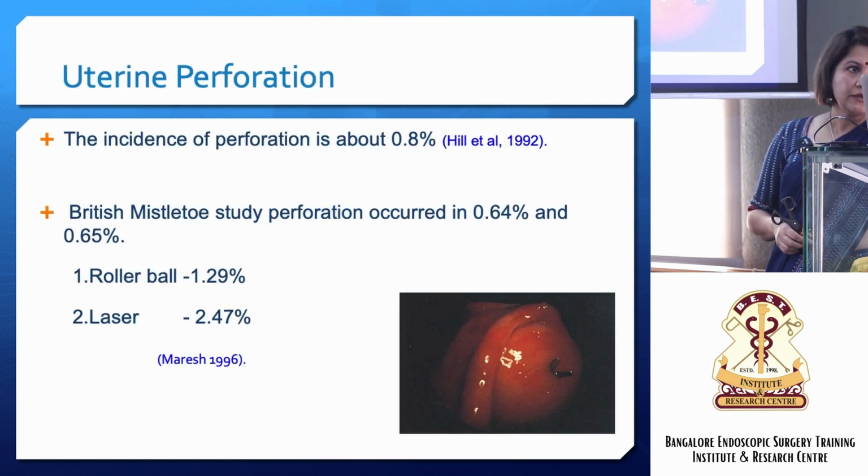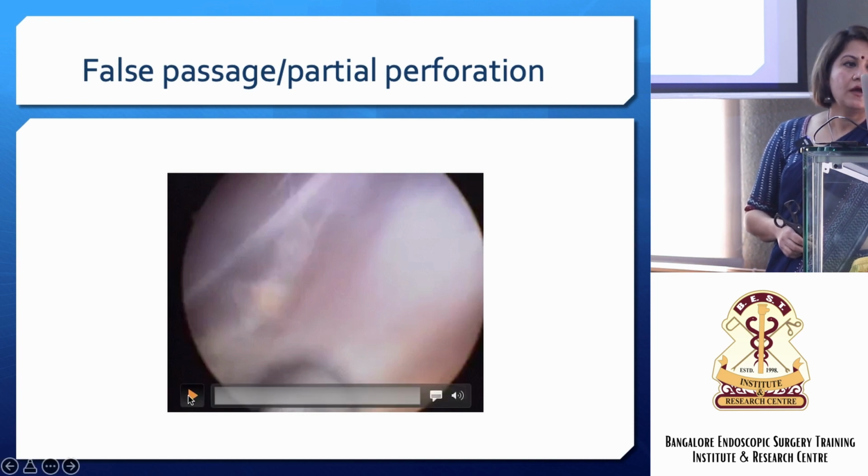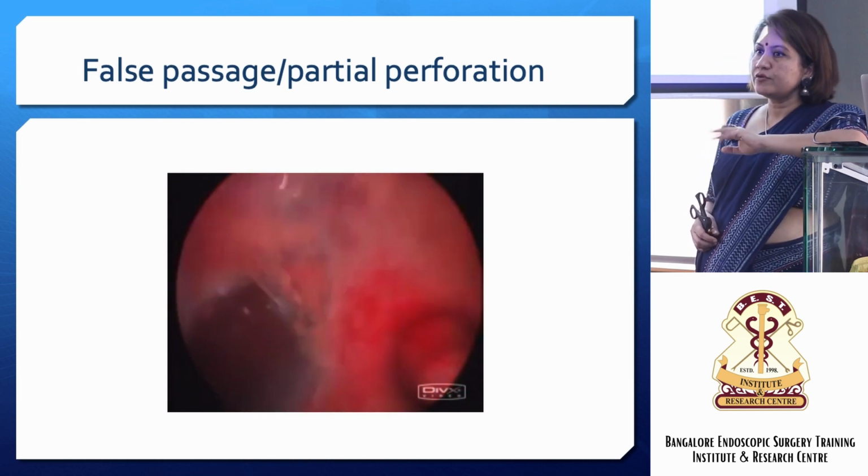Now, when it comes to perforation, this is a classical appearance when we have dilated the cervix blindly and gone through a false passage.